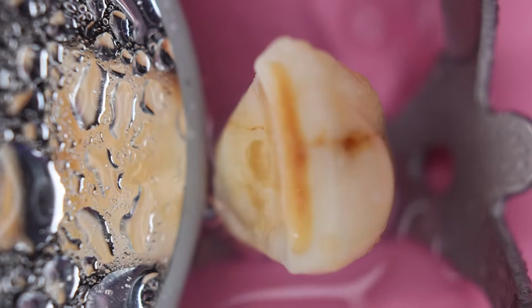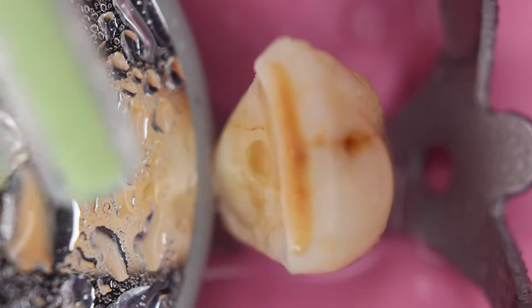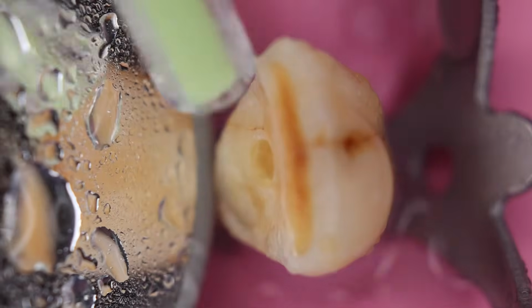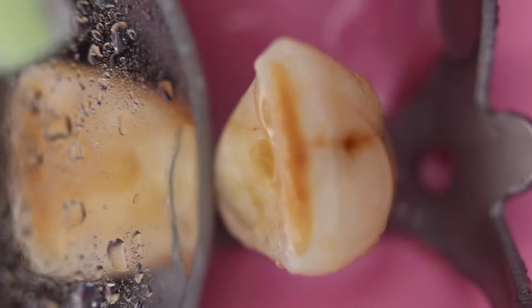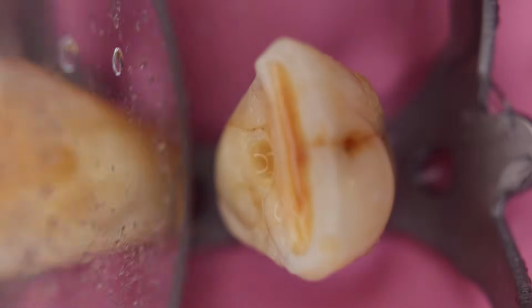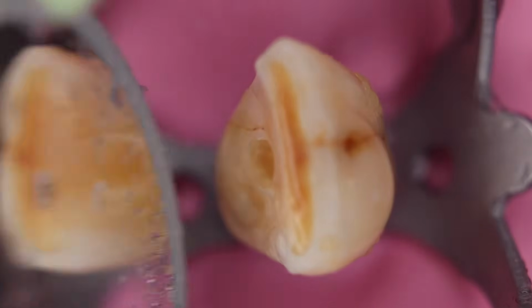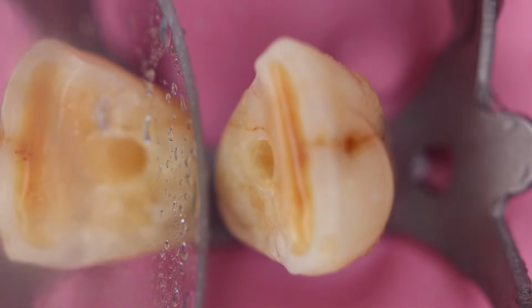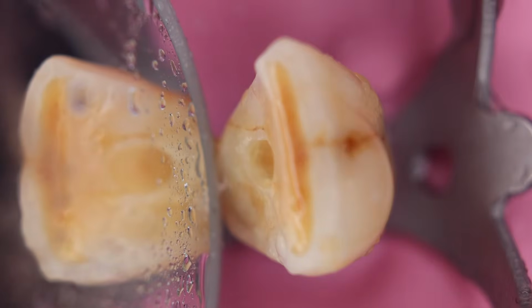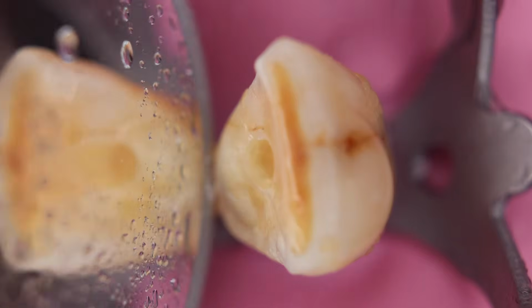So now you can evaluate the tooth. You can see that we are in 45-degree angulation and half of our burr has already entered. Now again going slowly.